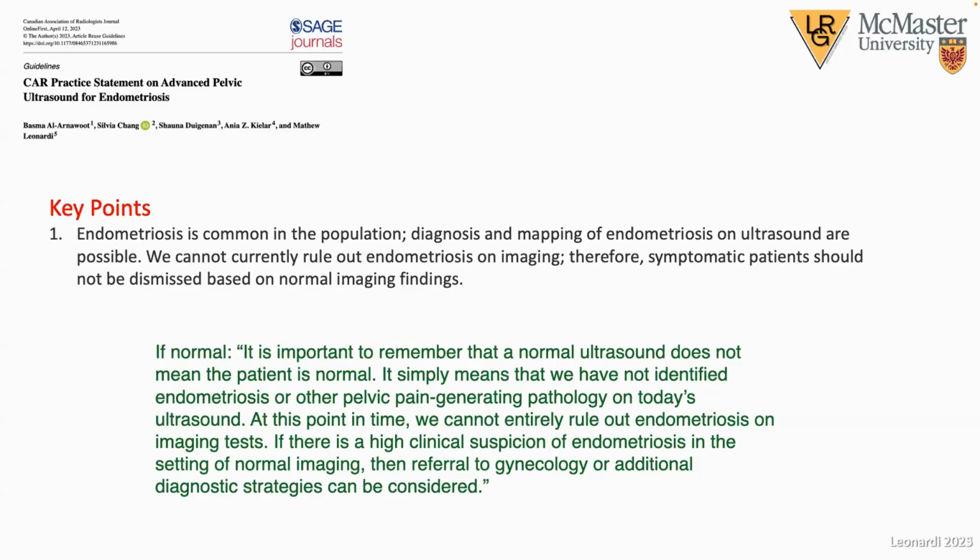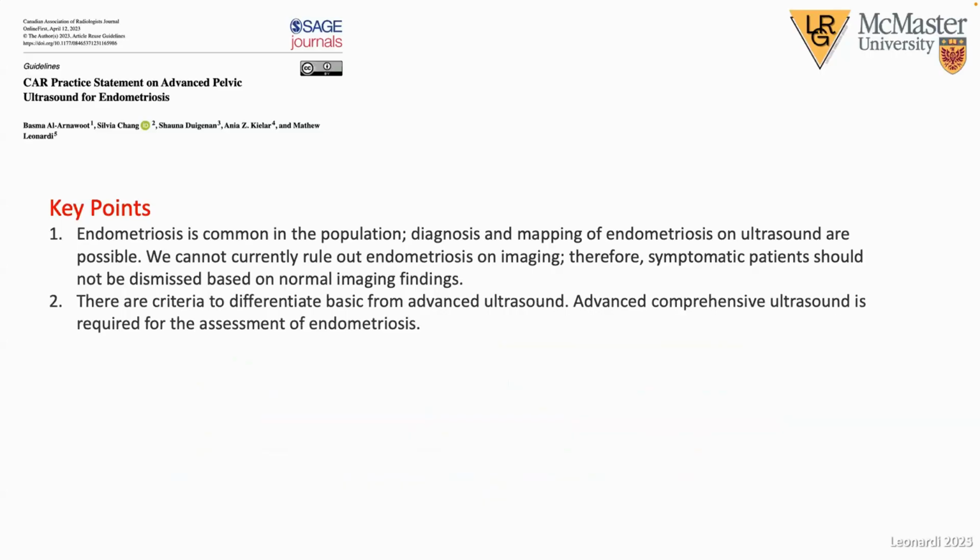But I can't say strongly enough that the people who are interpreting our reports don't always have the understanding of what the utility is. And that's also demonstrated in the numerous reports where we receive the requisition saying, rule out endometriosis. Obviously, we cannot do that, but people still want us to do that. So I really encourage you to make these types of statements at the conclusion of your imaging reports when it is a normal scan.